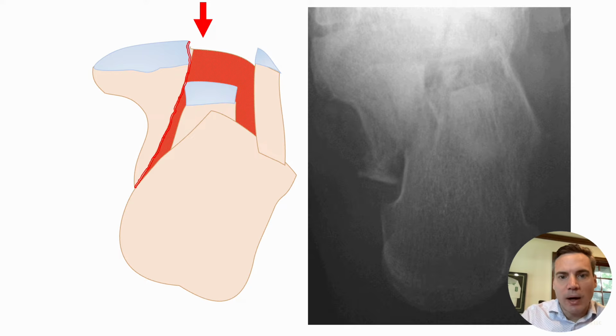So now we get a widened heel. You have the lateral wall blowout, which is accentuating that. You've lost your height because the tuberosity piece has shortened and we have depression of the joint surface. So this is all on this axial view. All of this is happening. We can see this on the axial view.